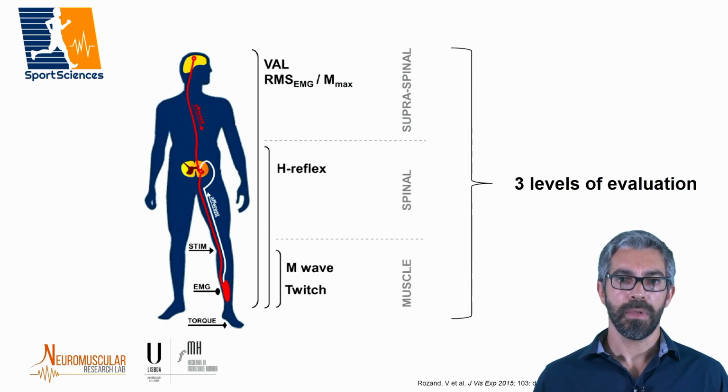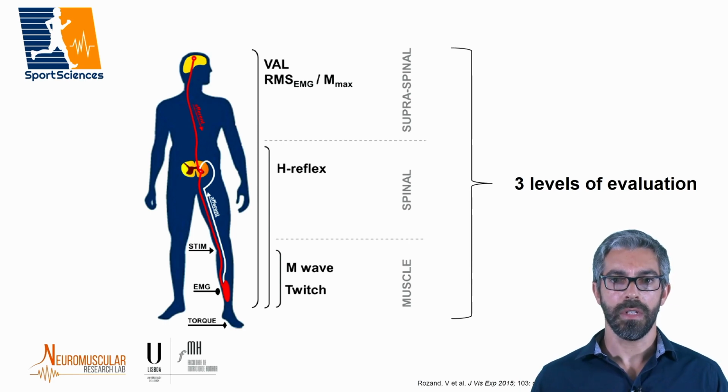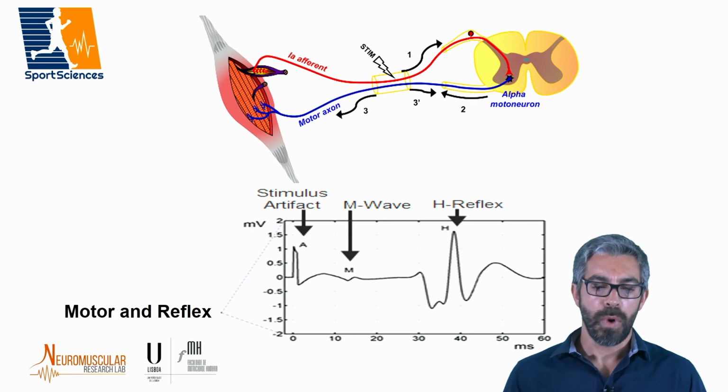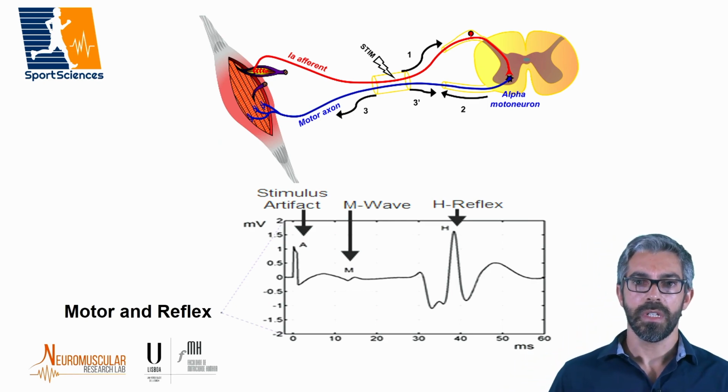Despite its practical applications, interpretations based on this technique may be contaminated by some level of bias that we will try to explain during our presentation. Therefore, caution is advised in what concerns direct interpretations based on these measurements. The primary purpose of using this technique is to measure evoked potentials.